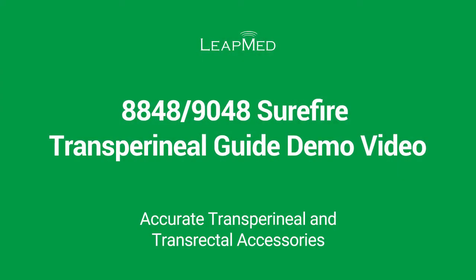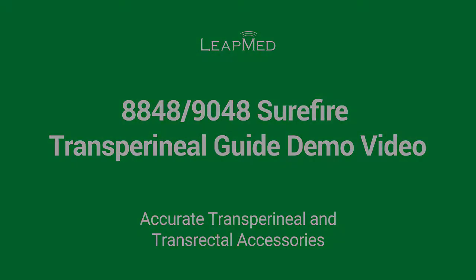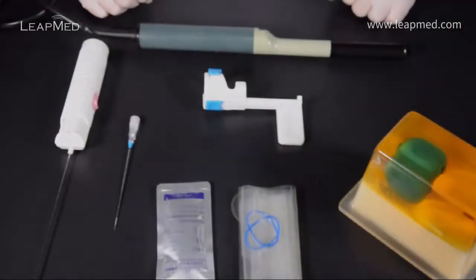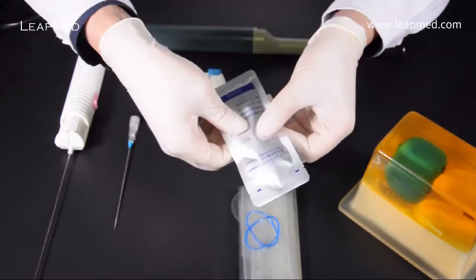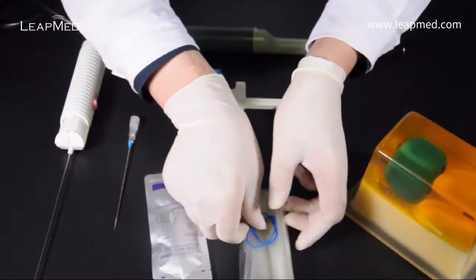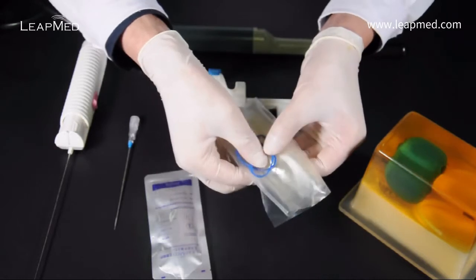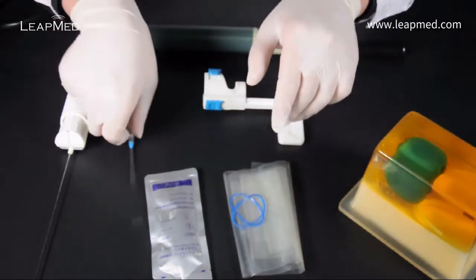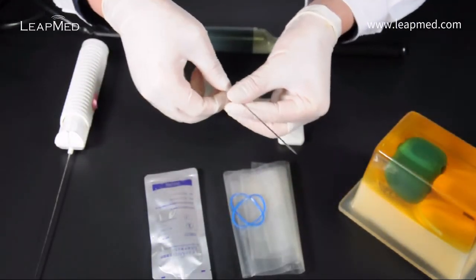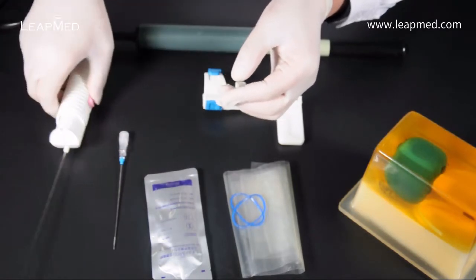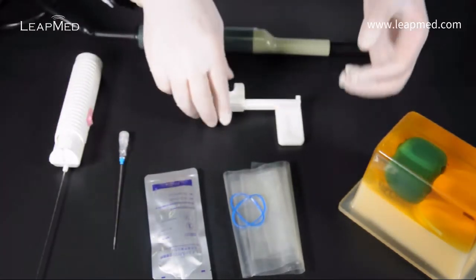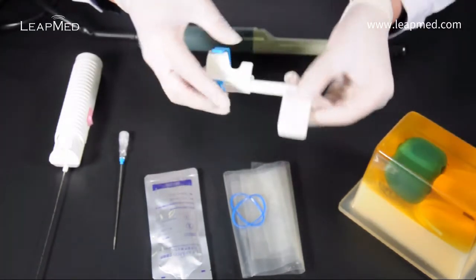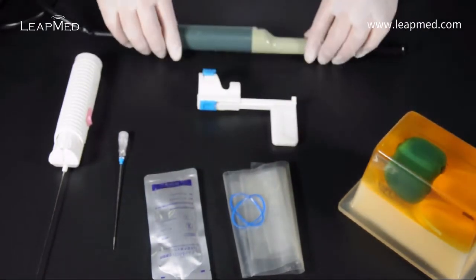The Surefire Transperineal Guide by LeapMed. The products used for transperineal prostate biopsy include sterile gel, probe cover and elastic band, coaxial introducer needle, an automatic biopsy needle and the needle guide or bracket, in this case the Surefire Needle Guide from LeapMed and the ultrasound probe.